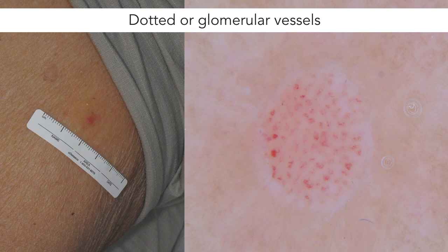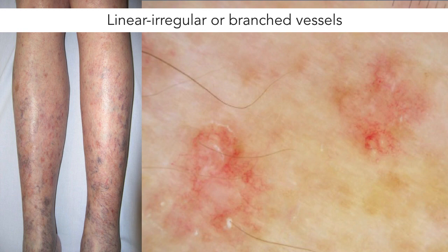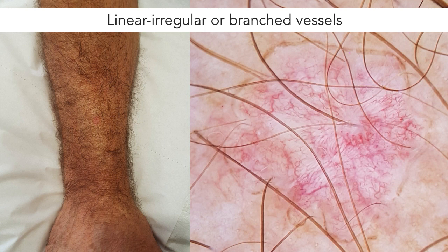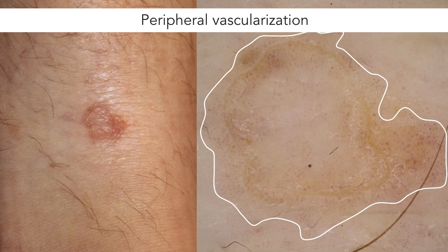This patient with DSAP had multiple lesions in which the vessels were linear and branched. In this solitary porokeratosis, we see very prominent vasculature with linear branched vessels. As you can also see, most of the keratin rim is pigmented in this case.